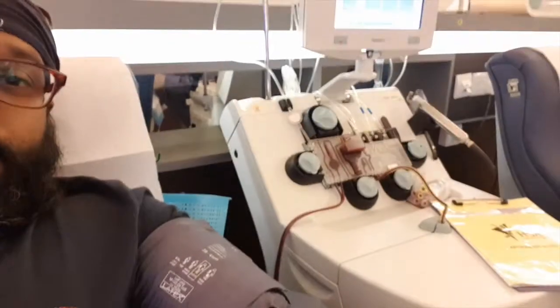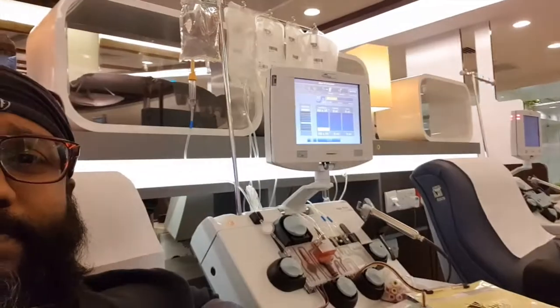Now the process has already started. Let's take a look at platelet donation, which is a little different from whole blood donation. You can actually see this machine there. The blood has been drawn and it will extract the platelets, and then the remaining component is sent back to your body. That's why they call it the apheresis donation — it only extracts the platelets and the remaining part of the blood is returned to your body.